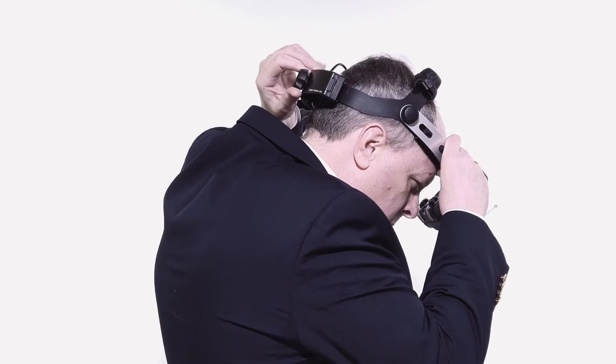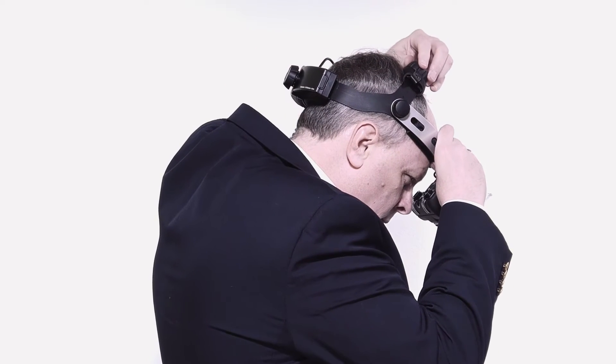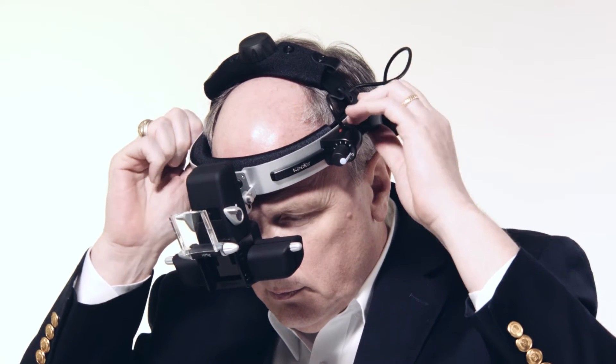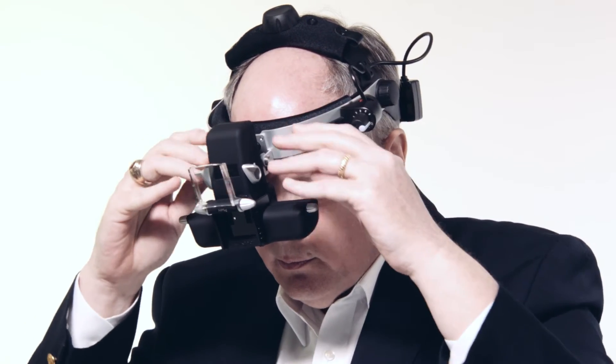Start by adjusting the size of the headband using the knobs on the back and top of the headband so that the instrument fits comfortably around your head. For vertical alignment, adjust the metal brow bar by loosening the tension knobs on the side of the headset.